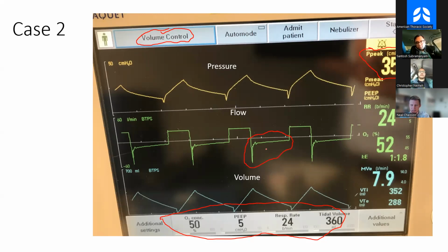And you go, oh, expiration, they didn't talk about that in ARDS. But what's notable about expiration, and I'm going to focus you right here. What's going on right at the end of that breath, or what's not happening? The waveform gives us this flat, like the flow is constant. Yeah, exactly. So the flow is not going back down to zero.